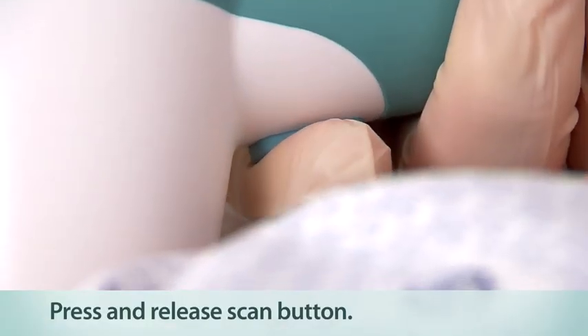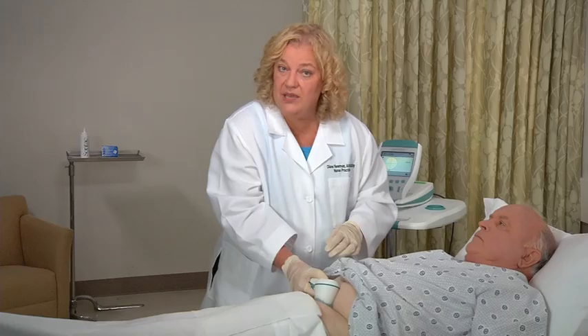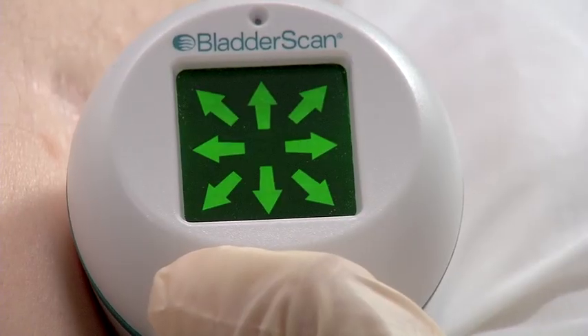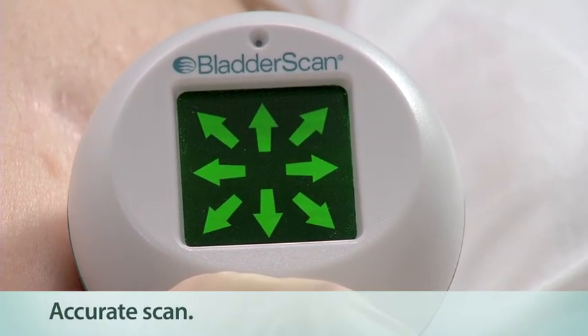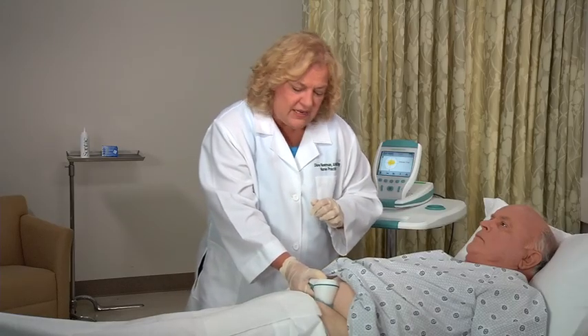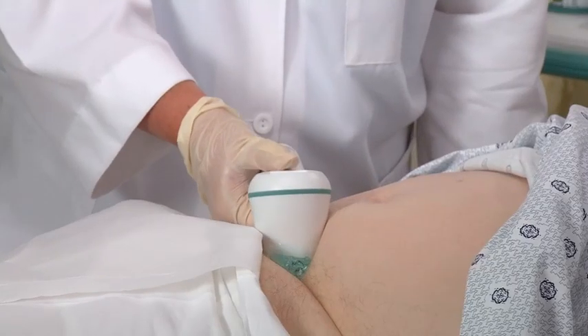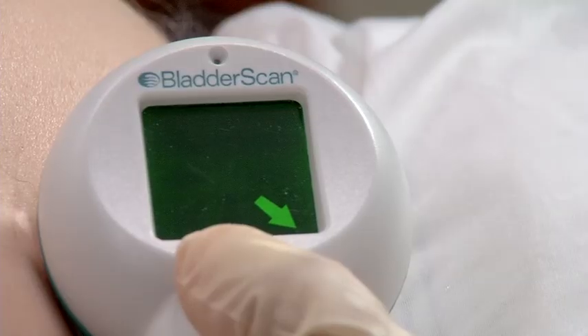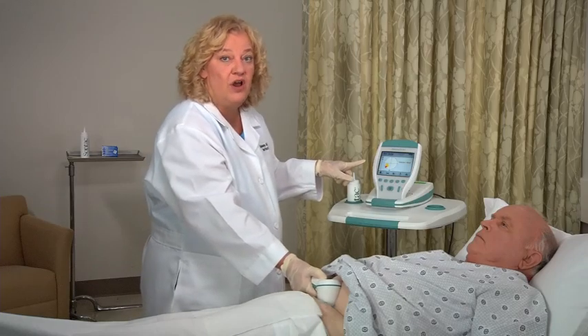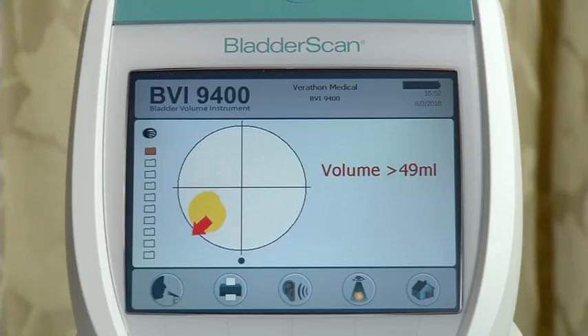When you hear a beep, the scan is complete and the bladder volume measurement is displayed on the console. You know the aim is accurate when you see all eight arrows flashing on the probe, and the bladder image is centered in the crosshairs of the console's aiming icon. If the scan is off target, the arrows on the probe indicate the direction of the bladder. A solid arrow means you are slightly off target; a flashing arrow means you are significantly off target. The console will confirm that the bladder is off target from the crosshairs, and an arrow will point in the direction of the bladder.